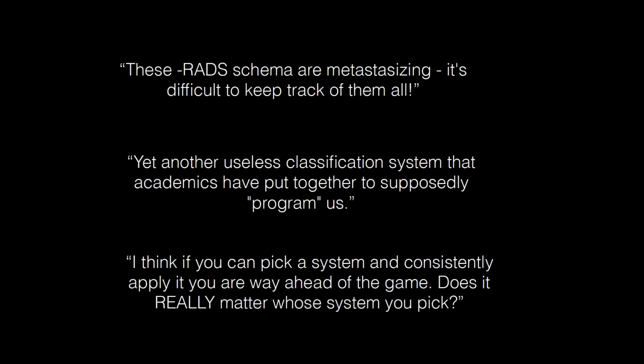And they're referring to BIRADS, LIRADS, PIRADS. But I think it's great that they're metastasizing, personally, because it makes us all better radiologists, because we're all reporting the same way. A patient coming in for an ultrasound isn't going to get a different recommendation because I report it or Alan Rosen reports it.